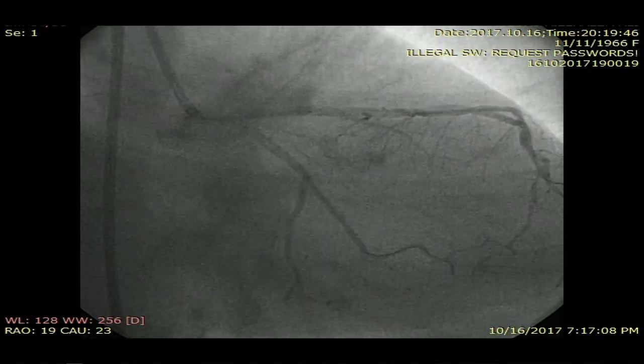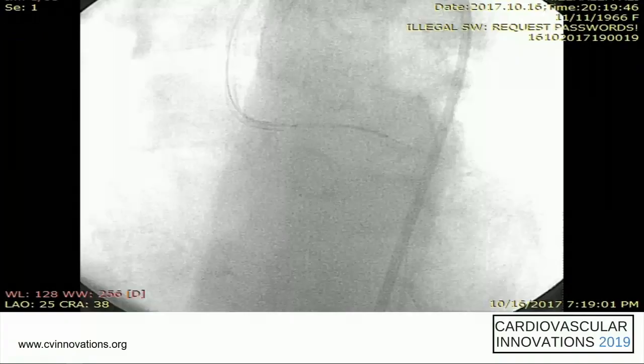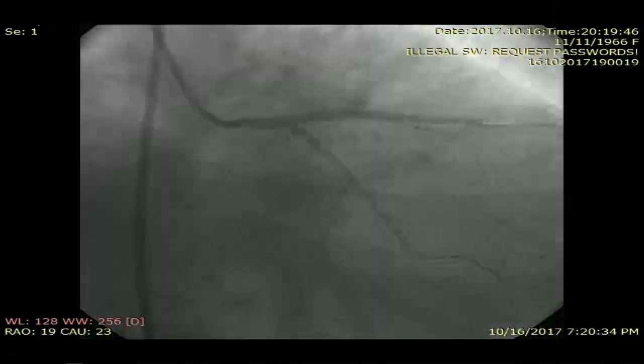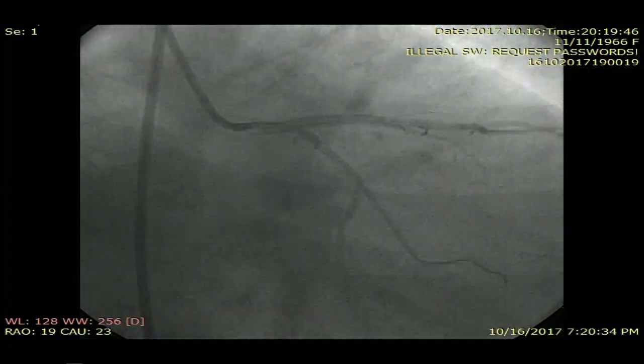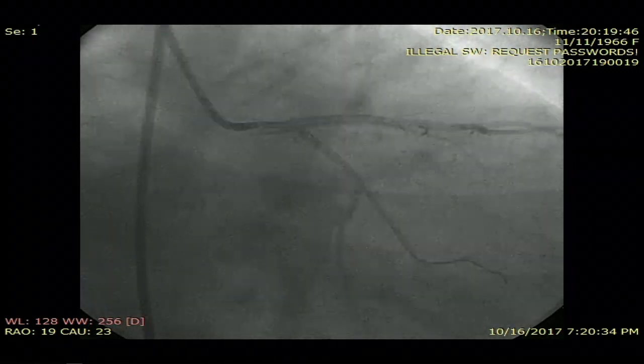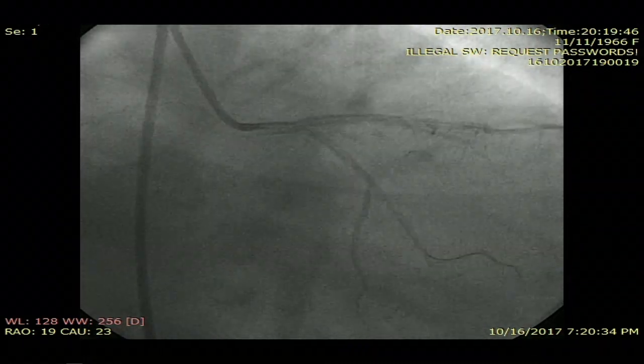These are the guide wires. First, we stented the left main LAD with a drug-eluting stent. It passed smoothly without any problems. After deploying the stent in the left main LAD, we thought that the ostial CIRC was more compromised, and it required another stent because it appears more significant right here after deploying the LAD stent. So we decided to complete the procedure as a TAP technique.